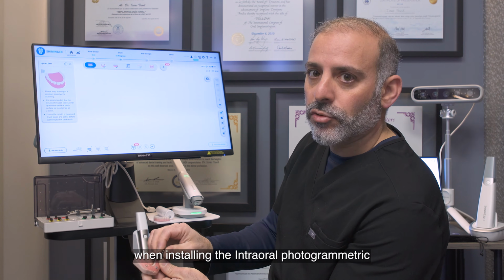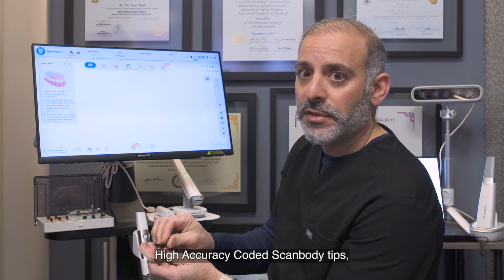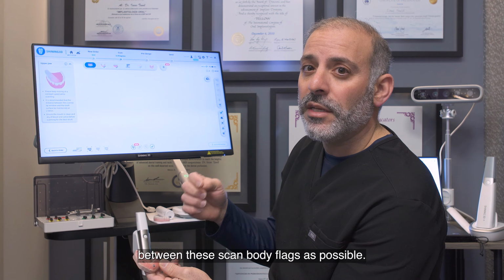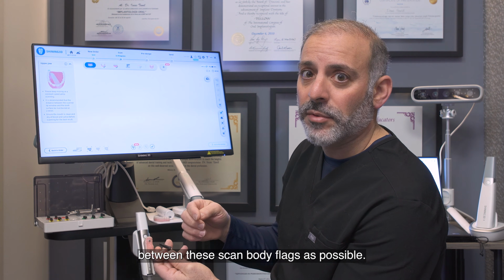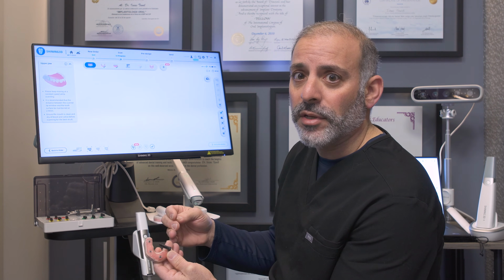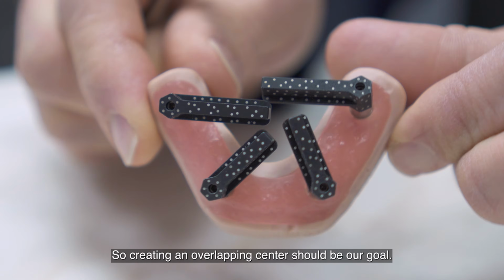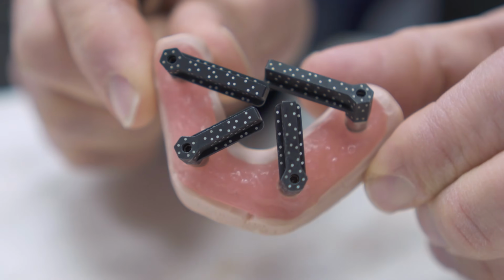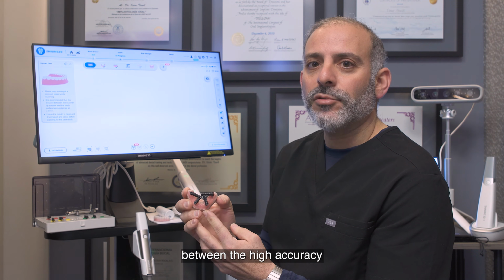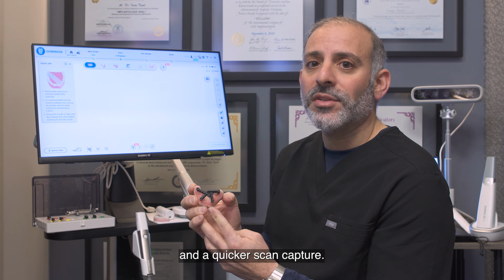When installing the intraoral photogrammetric high accuracy coded Scanbody tips, it is important to provide as much overlap between these Scanbody flags as possible, as the further away these distances are, the less accurate the scan will be. So creating an overlapping center should be our goal. In an ideal solution, having an overlap between the high accuracy coded Scanbodies will provide higher accuracy and a quicker scan capture.